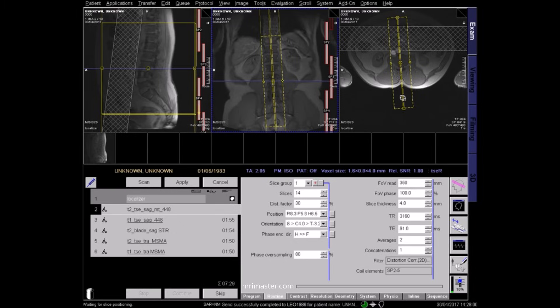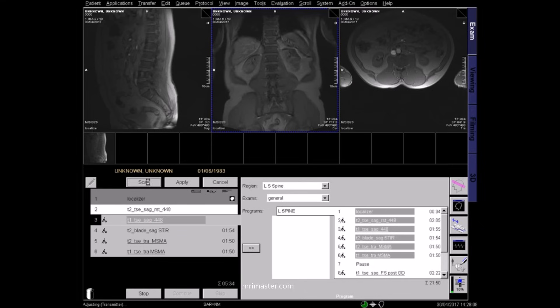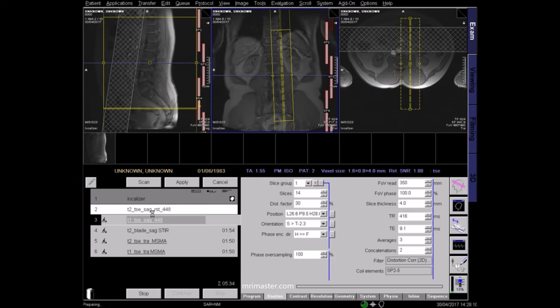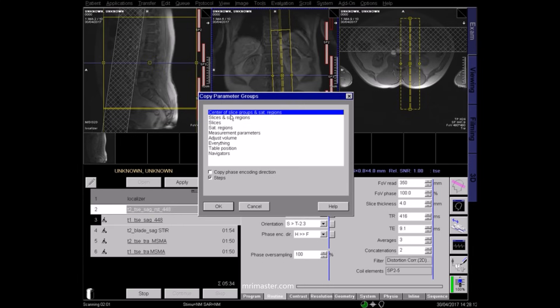Check that the coils are turned on and apply. The planning for the subsequent sagittal sequences can be copied from the first sagittal sequence.